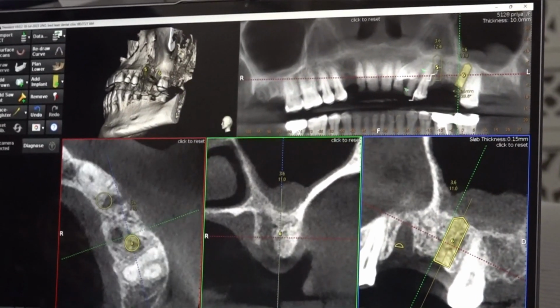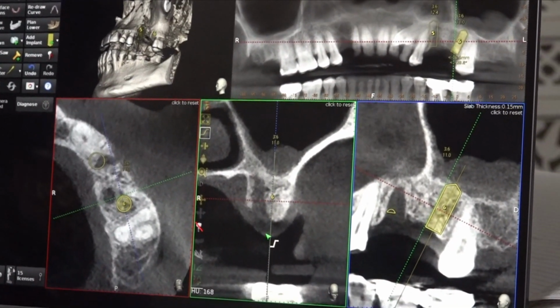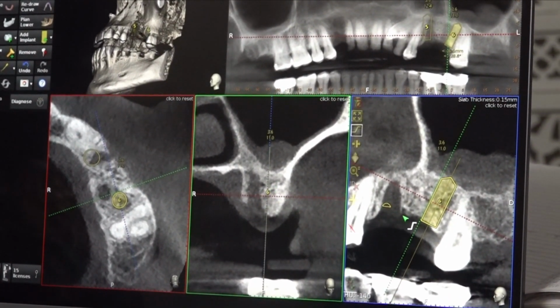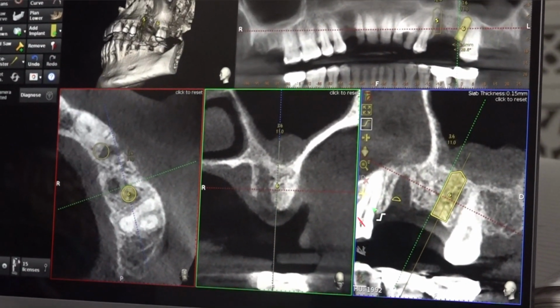Okay, this palatal socket first. Then using it as a guide line, just drill distal to that palatal socket defect. Okay, this is one option.